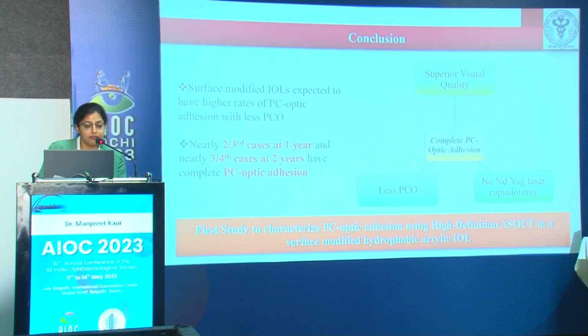So to conclude, surface modified IOLs are expected to have higher rates of PC optic adhesion with less PCO. Nearly 2/3 of cases at 1 year and 3/4 of cases at 2 years have complete PC optic adhesion. However, 1/4 of cases still have persistent PC optic inadhesion, and complete PC optic adhesion leads to less posterior capsular opacification rates, superior visual quality, and no need for Nd:YAG laser capsulotomy.